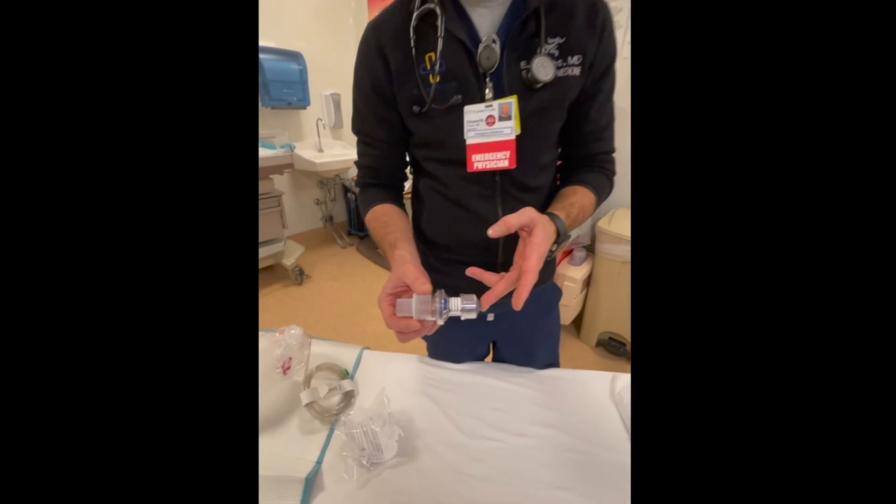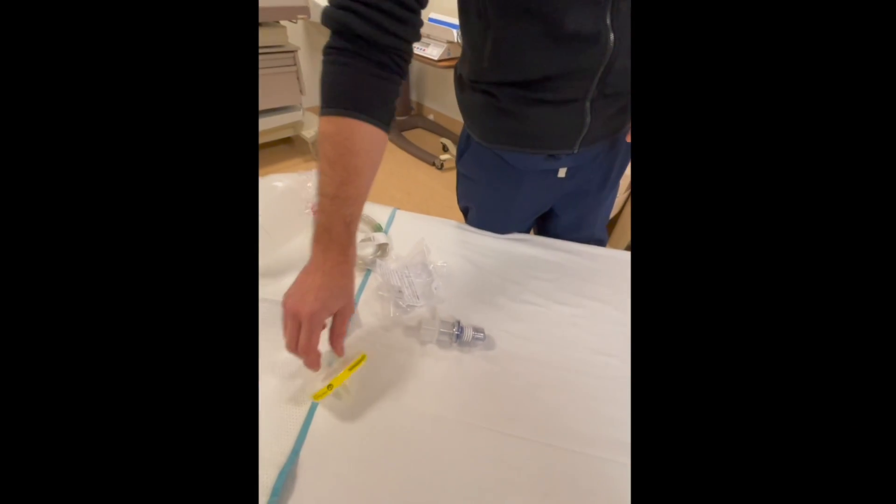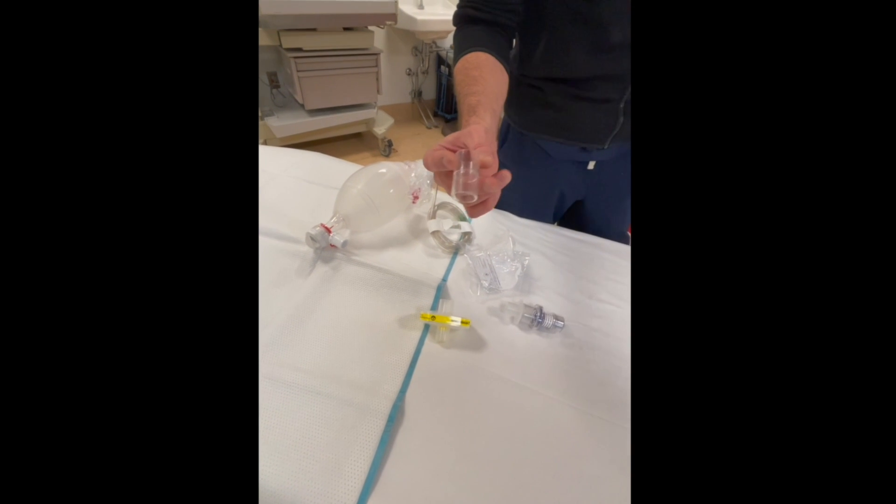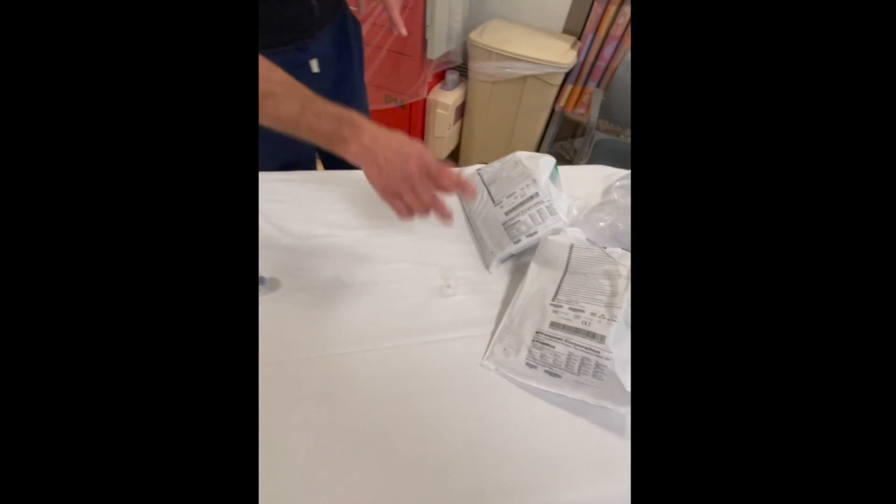You need a PEEP valve which is going to look like this, a viral filter which is going to look like this, potentially a connector which is in the BiPAP mask container, and then you need a BVM.